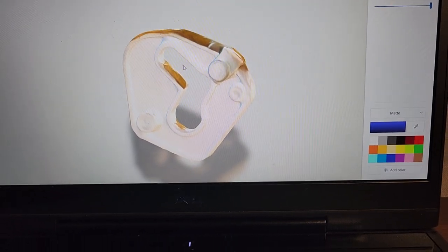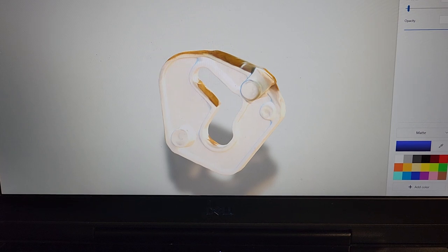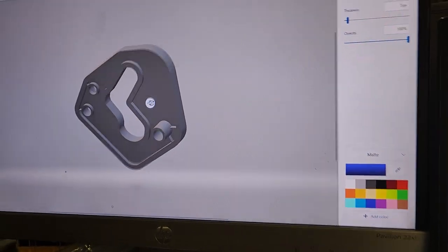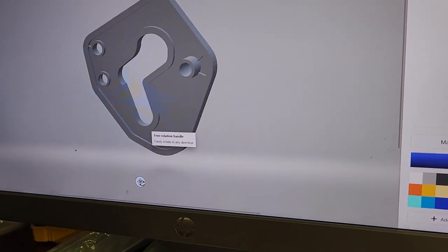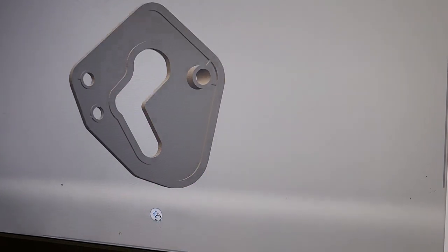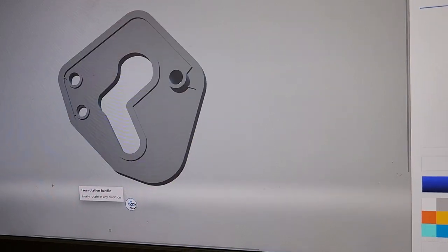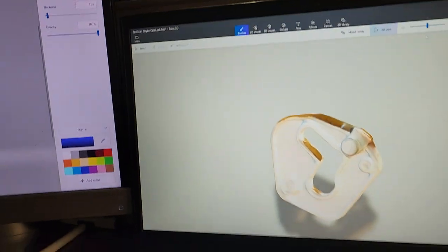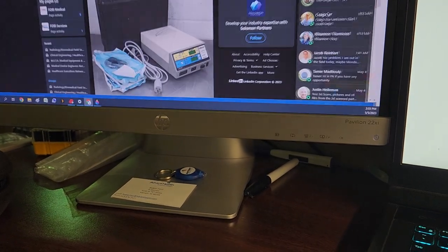But when I did, I sent those pieces of data off to Pakistan and I had somebody professionally 3D model it, and this is what I have. So this part right here, you see, you can move it around in 3D space. Looks fantastic. The guy that did the modeling did a beautiful job. So this is a part that's almost impossible to get right now. And I was able to basically get everything together and make another one. So what am I going to do with that? Well, now that I have this, I had a version of it printed.